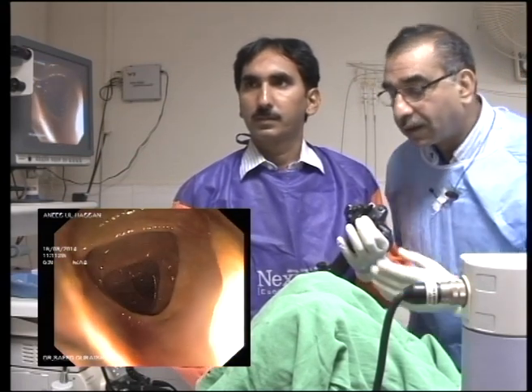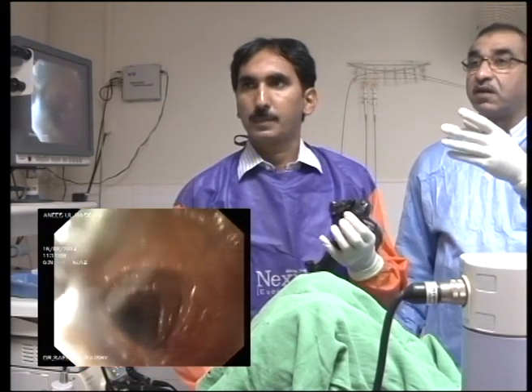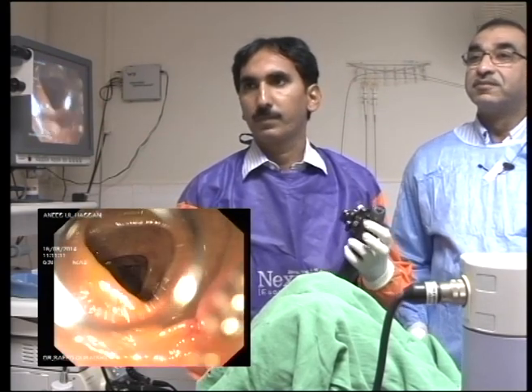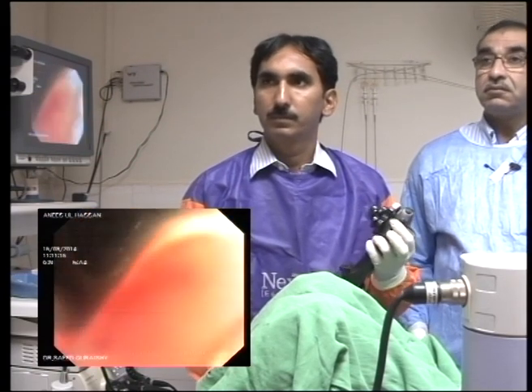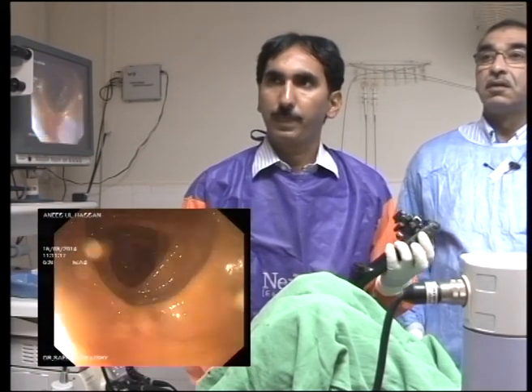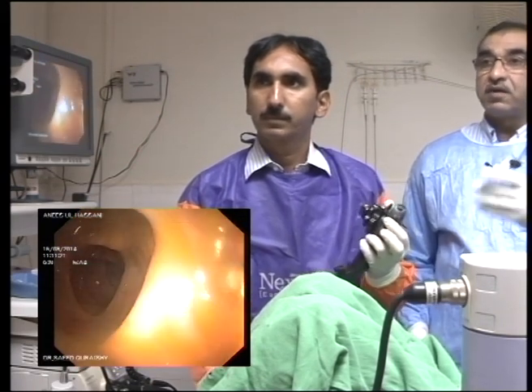What you're going to do is make your colonic configuration more difficult. Advance, why are you just standing there? And you also create resistance. So air can be your worst enemy in colonoscopy. It is your friend as long as you advance. Use it little.